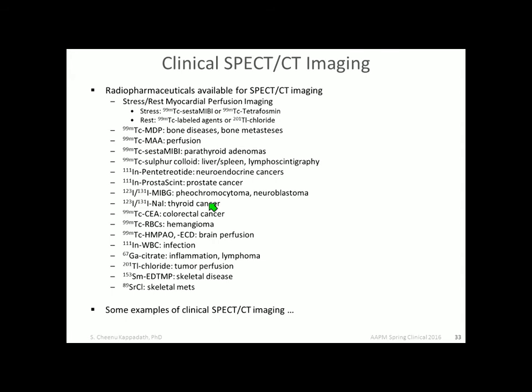Okay, so those are the two things. Like I said, the important thing is really this registration test that we think is important to do. We have service events where the gantry of the SPECT and the CT is split apart, and we verify these things every time the gantry is split apart. So it's not only just for annual, but any time the integrity of a SPECT CT system is compromised, we recommend that this be evaluated.